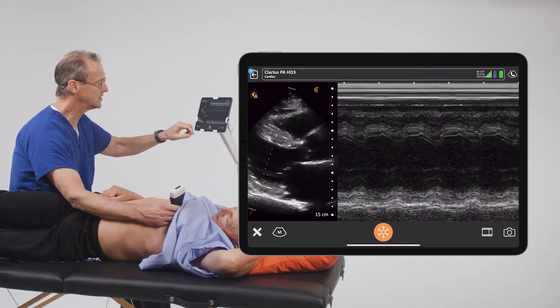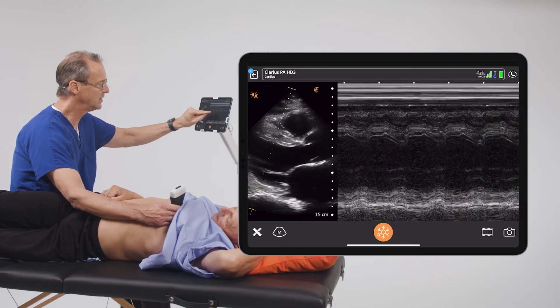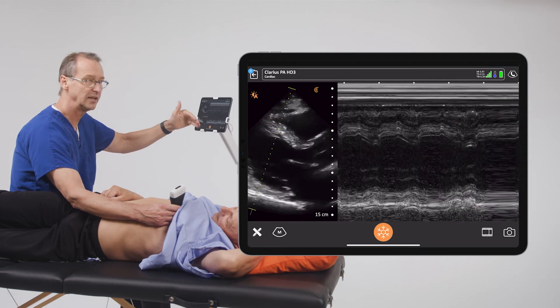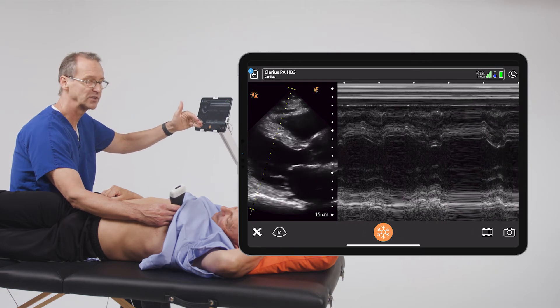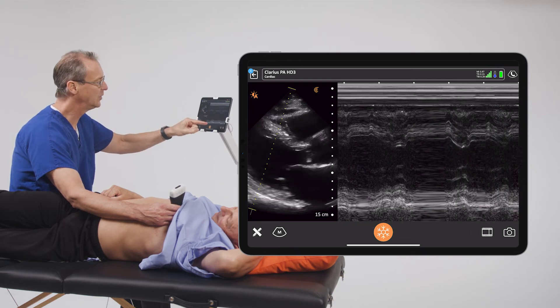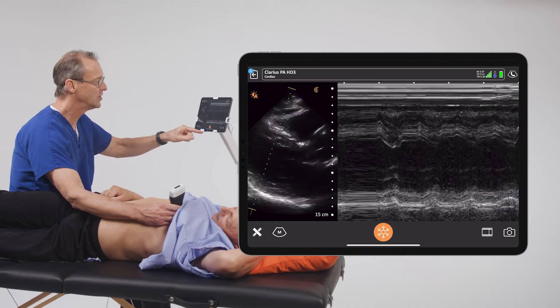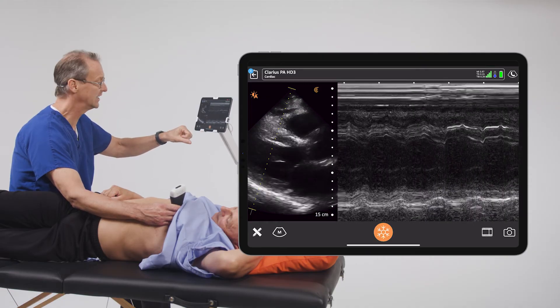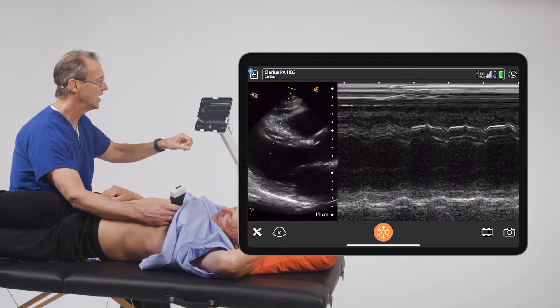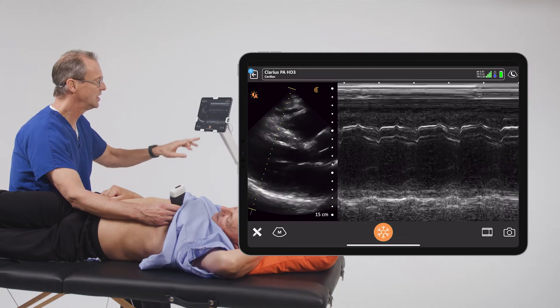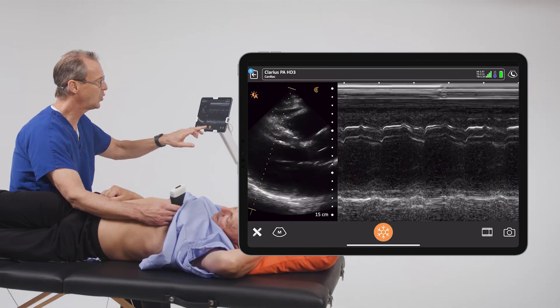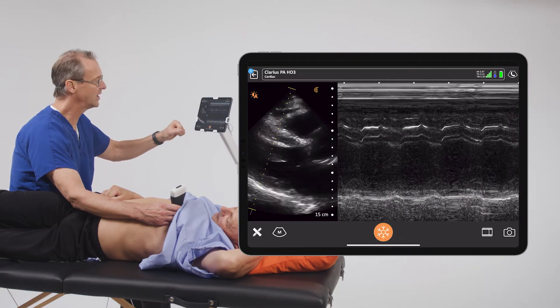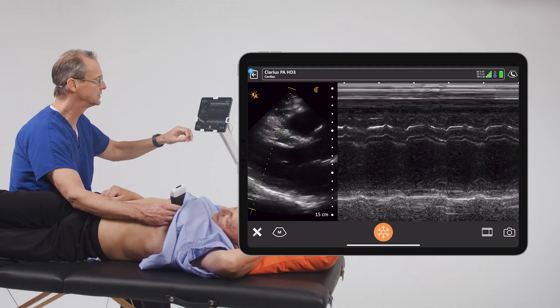It stands to reason that when these two structures get closer together, you are at the end of systole. And when they are farther apart, you are at the end of diastole. We can use this as a strategy to quantitatively evaluate how well the left ventricle functions.